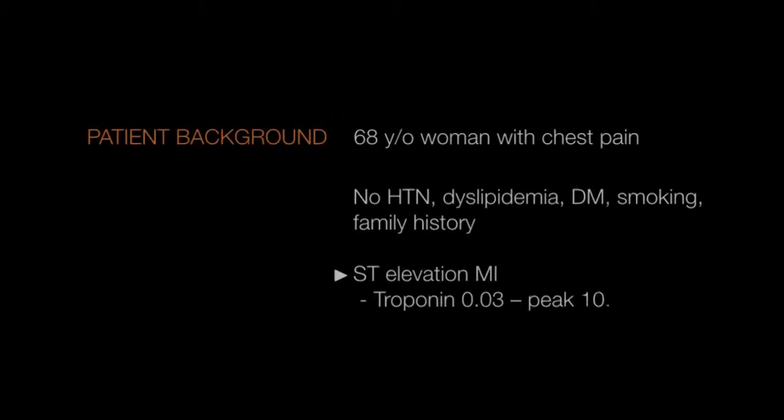We had a patient with an ST elevation myocardial infarction who had almost no risk factors for coronary disease. She presented with classic crescendo accelerating angina over the course of an hour or two, presented to our emergency department, and had ST elevations in the anterior leads. When we took her to the cath lab, we saw a hazy cutoff in the apical portion of her LAD that looked like thrombus, but no obvious focal lesion.